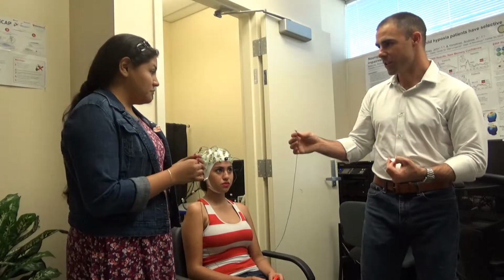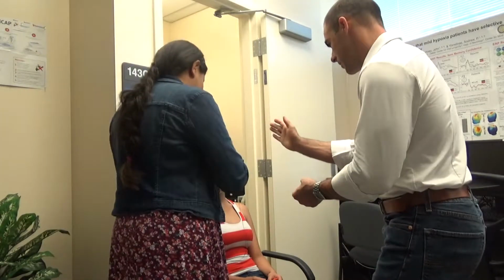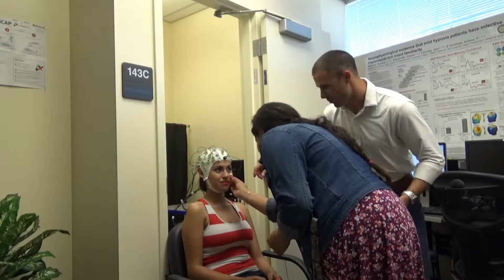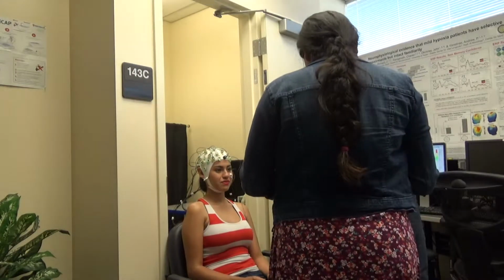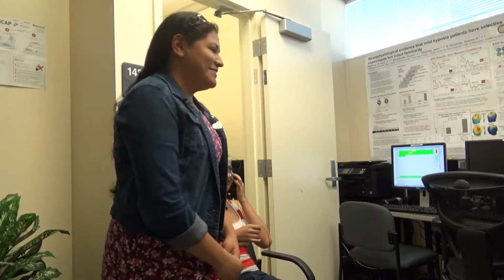You want to put that right in her cheek. You want to align it with her pupil, so you gotta stand right in front of her, kind of where I am. So kick me out of place, and then you want to put it right about there. Not on the actual eyelid, perfect. No higher. Yep. Perfect. Okay, and you can even ask her to hold this for you. Perfect. Now we've got a few more.